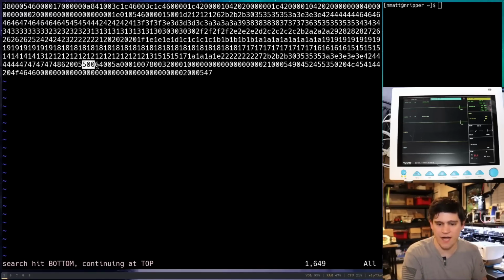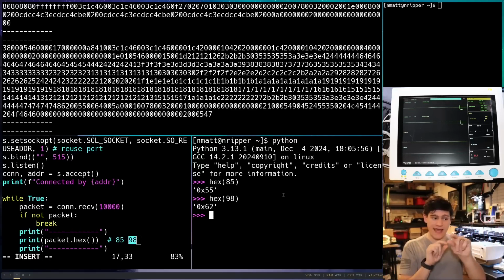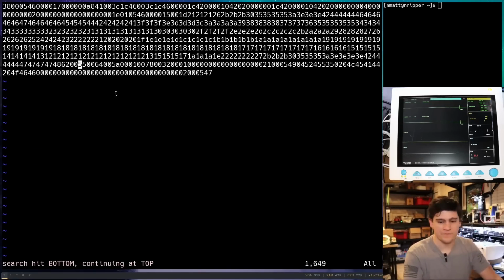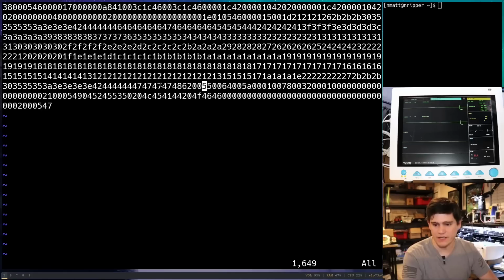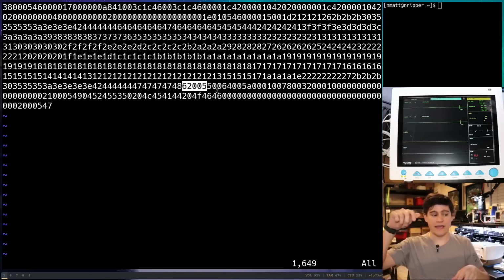So here we have that 55, and then what do we have here? We have 62. Oh, we have a 62 actually ahead of this. Well, what's 62? Let's go back, because I'm guessing it's that other number we're looking for. Hex. Boom, there we go. Okay, so now we've found these two pieces of data here. Let's make this nice and big. What we want to do is find the offset of this first piece of data here. And you'll notice it goes 62 and then 00, and then 55 and then 00.